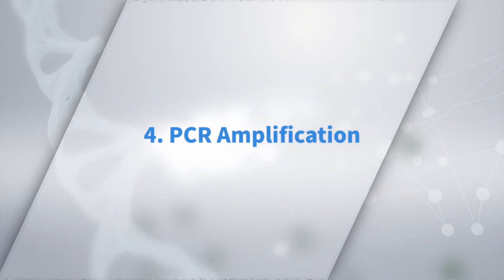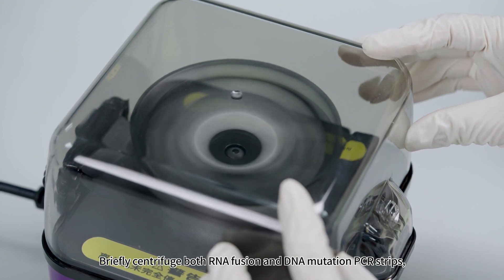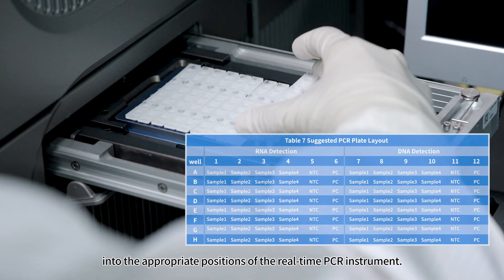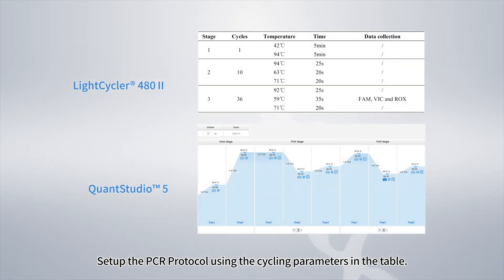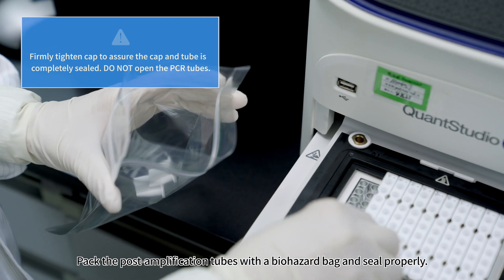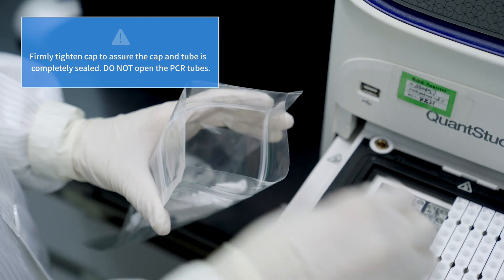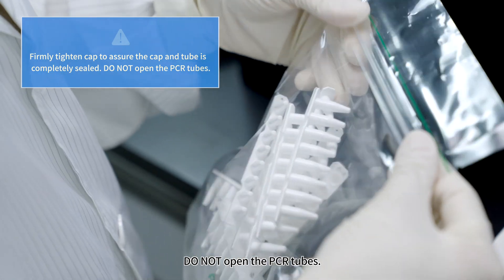For PCR Amplification, briefly centrifuge both the RNA fusion and DNA mutation PCR strips. Place the strips into the appropriate positions on the real-time PCR instrument according to the recommended plate layout. Set up the PCR protocol using the cycling parameters in the table and start the run immediately. After the run, take out the PCR strips promptly, pack the post-amplification tubes in a biohazard bag, seal properly, and firmly tighten caps. Do not open the PCR tubes.